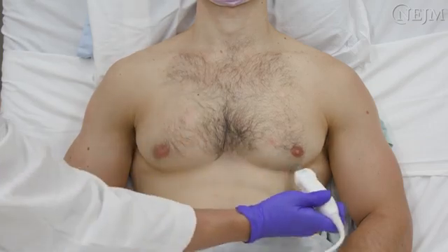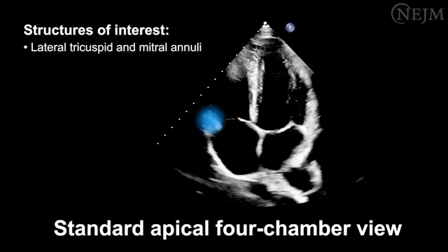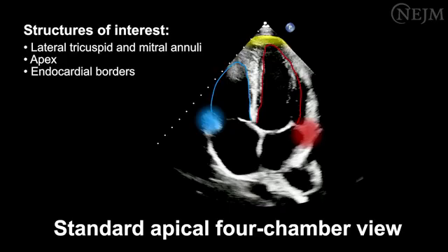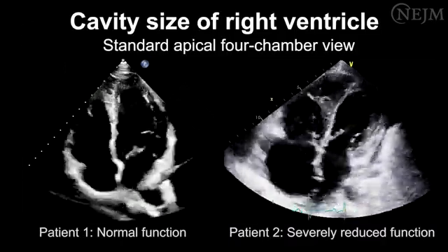In the standard apical 4-chamber view, identify the structures of interest, including the lateral tricuspid and mitral annuli, the apex, and the endocardial borders of the right and left ventricles. Evaluate the cavity size of the right ventricle relative to that of the left ventricle.